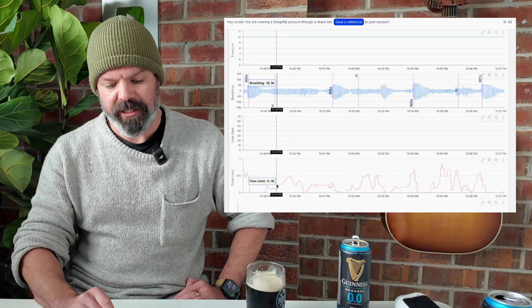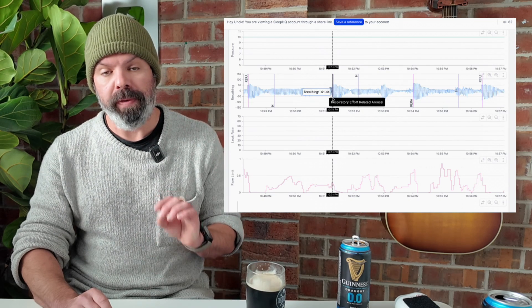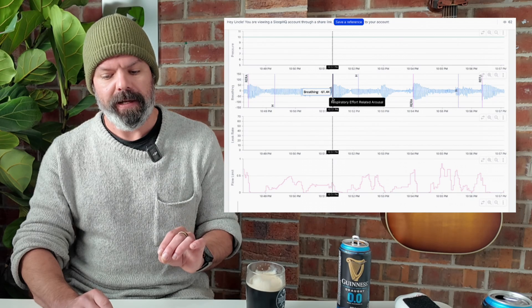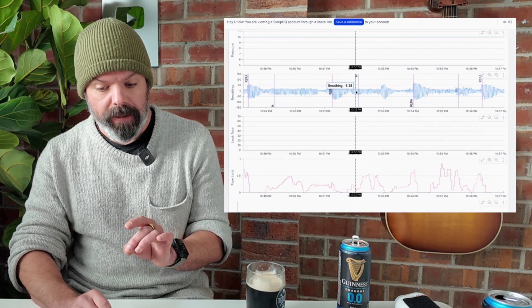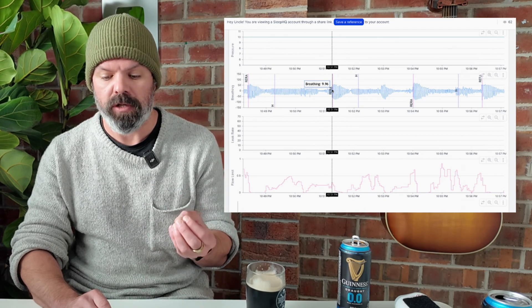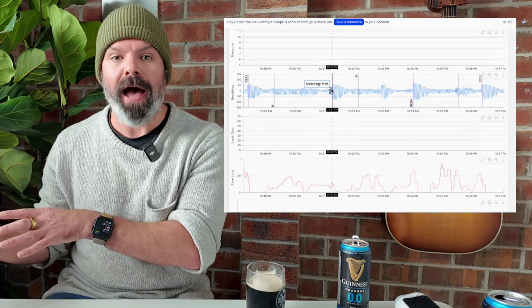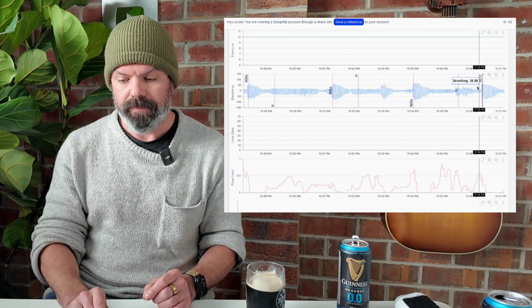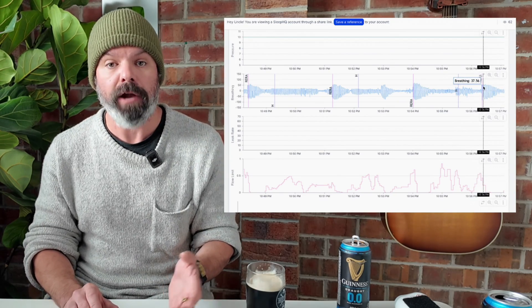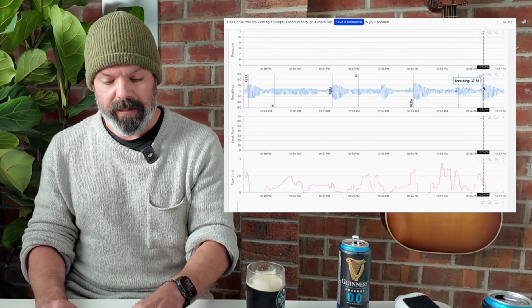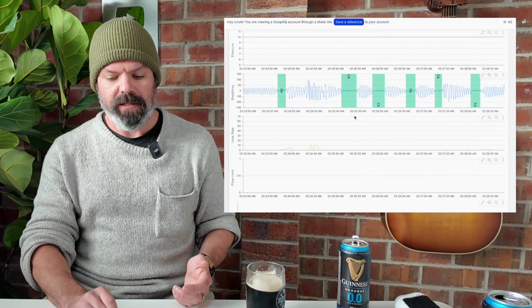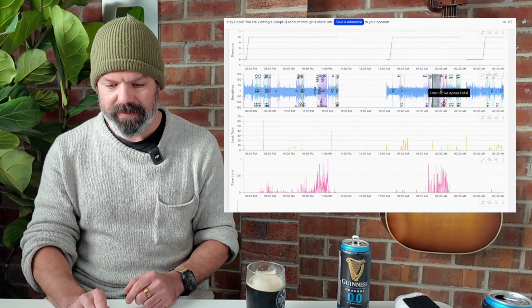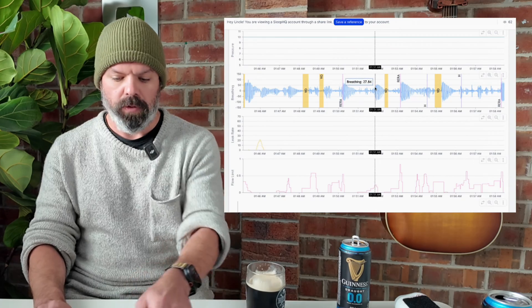Look at all the airflow limitation now. And we have these RERA flags, respiratory effort related arousals. They don't quite meet the threshold of a hypopnea or an obstructive apnea, but it is causing you to wake up. That's the arousal part. Your breathing is causing sleep disturbance. And this is stuff that's just not mentioned in the MyAir app and so on. And this is why you need to start using SleepHQ guys, because you can see one here. There's lots of them. So right now you guys could be having 10, 15, 20, 100 of these a night. You wouldn't know because it's not part of the AHI, but it's going to cause a lot of sleep disturbance. And if we come across to this central period again, look, central apneas, no flow limitation. Reset, come to this section here. We've got messy airway, obstructive apneas, RERAs, hypopneas, all this flow limitation.